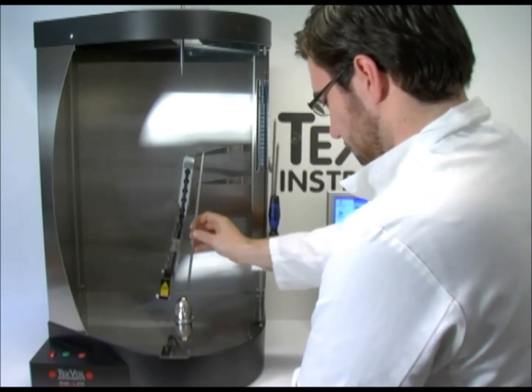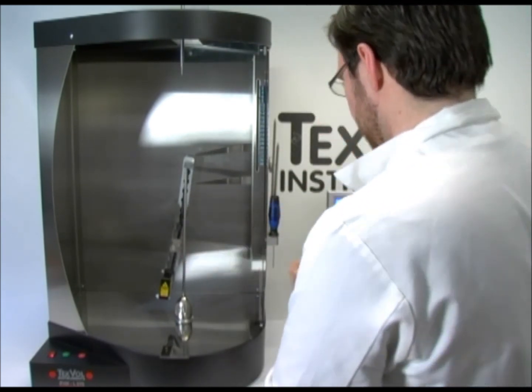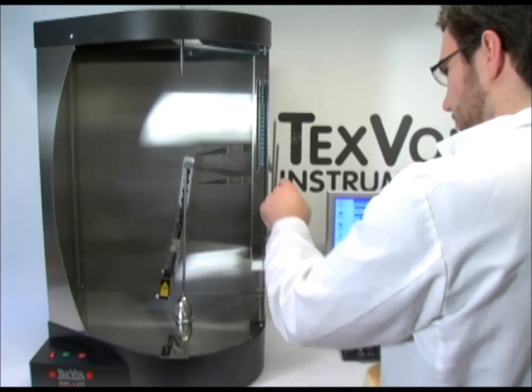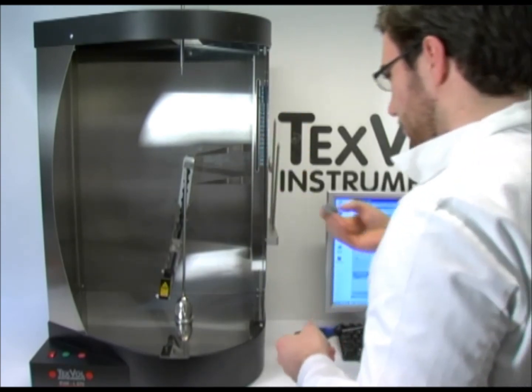For small objects, it is not necessary to use the top support shaft. And for round products, it is not necessary to position the product using the red marking on the chuck.